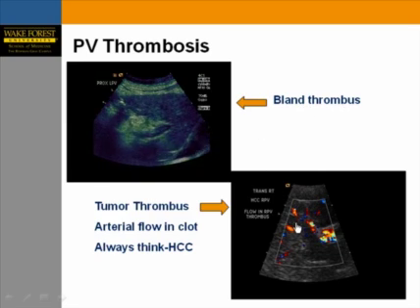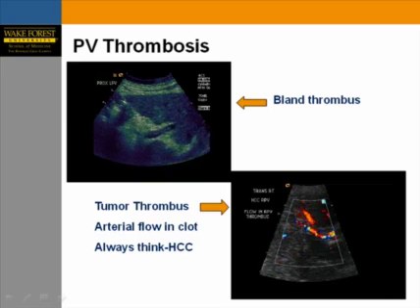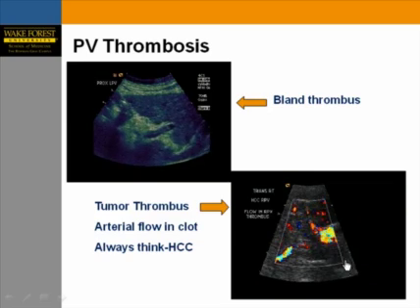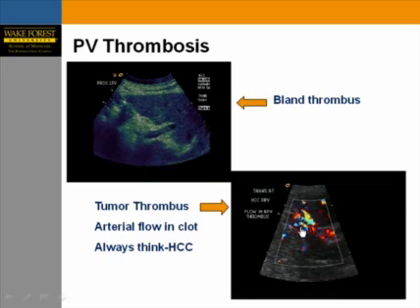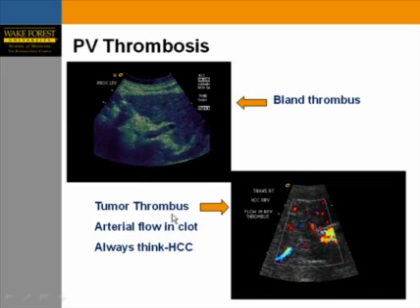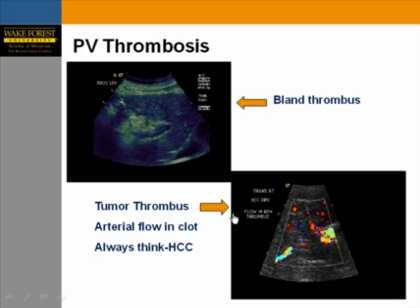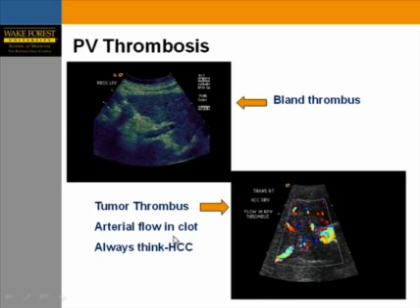Comparing that to another example: the portal vein is very expanded, barely distinguishable from the liver parenchyma, with an arterial signal within the clot — raising suspicion for tumor thrombus. In any cirrhotic patient with a tumor thrombus, always think about hepatocellular carcinoma.